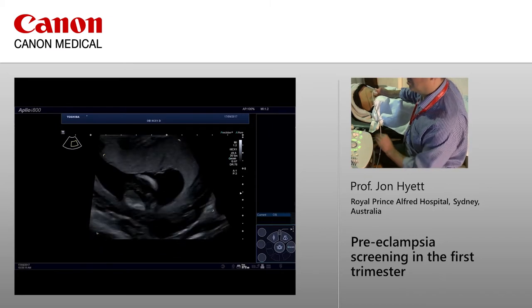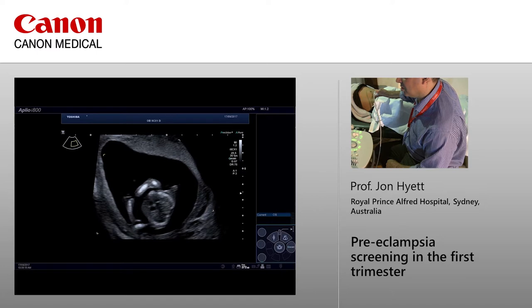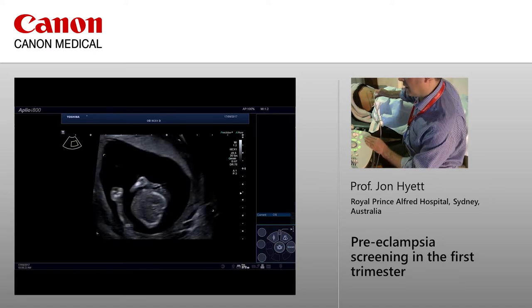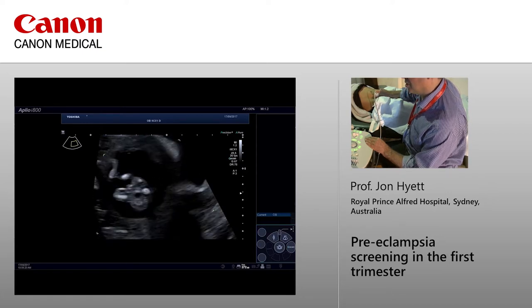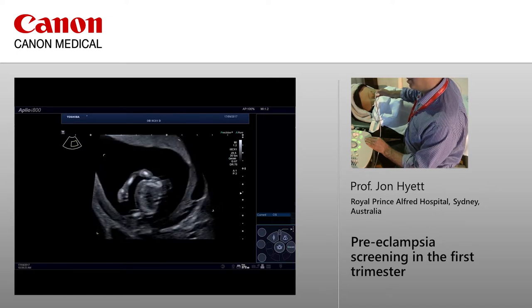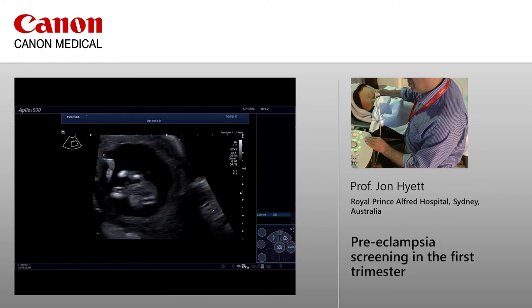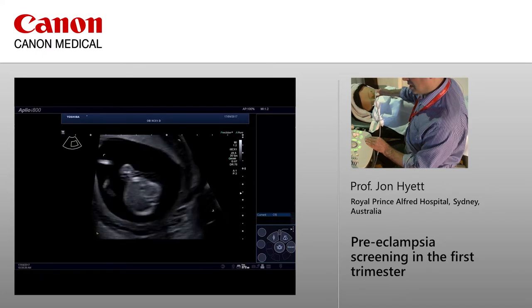Just as I scan through quite briefly, you can obviously see the chest here, you can see the four-chamber view. And we've got the two arms and hands out front. Working our way through, we've got the two legs down the bottom end there. Just coming back for a moment, you can see the stomach below the level of the heart, so that's nice. And you can see the abdominal wall looks intact as well.